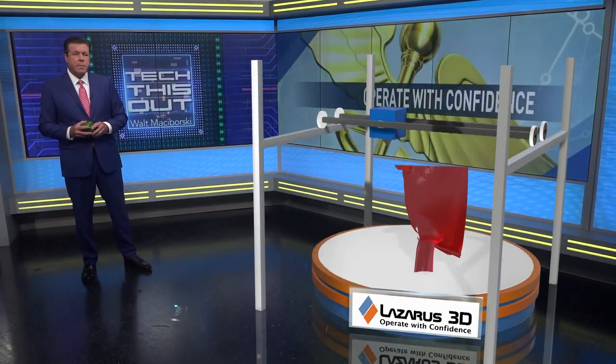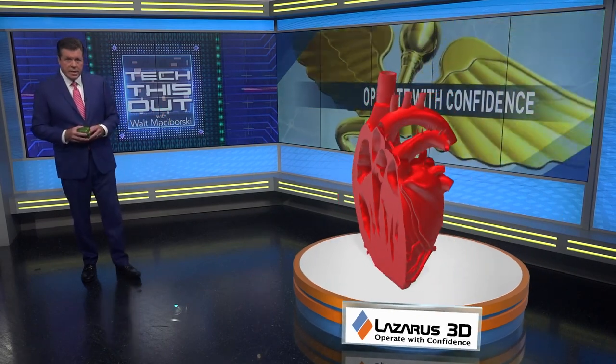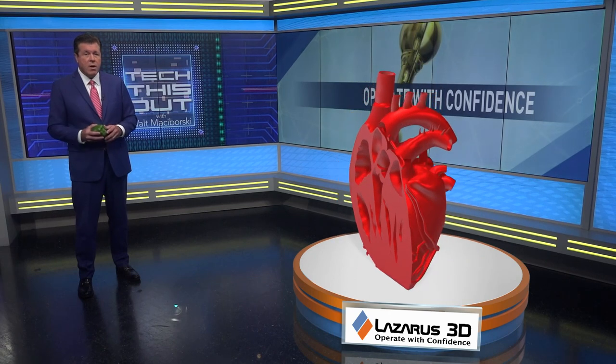But Texas-born Lazarus 3D thought there must be a better way, so they developed a system to transform patient imaging into 3D-printed organs so surgeons can rehearse with confidence and practice on an exact replica of the patient's tumor or cyst on their liver, lungs, or heart.